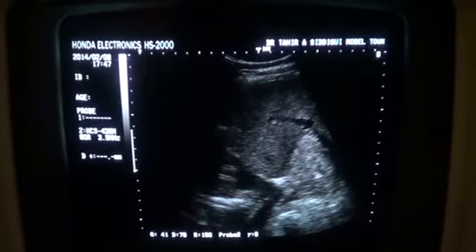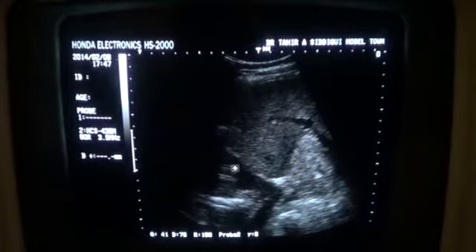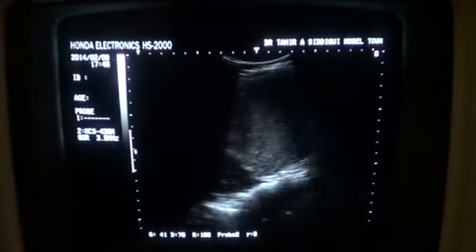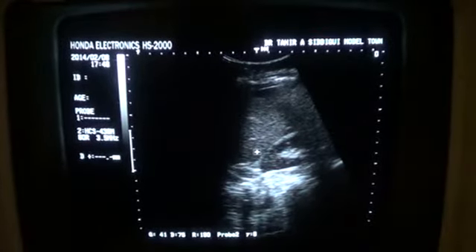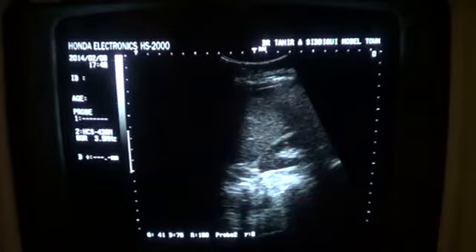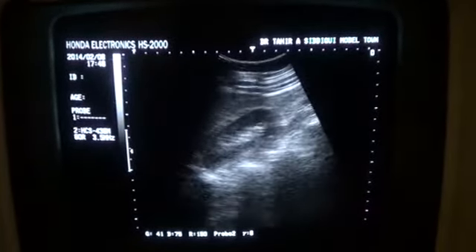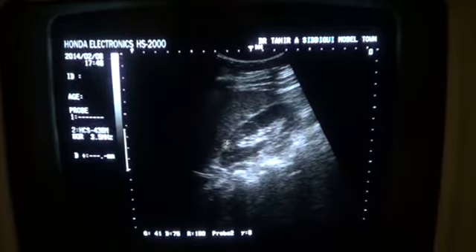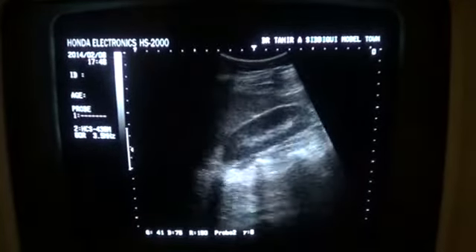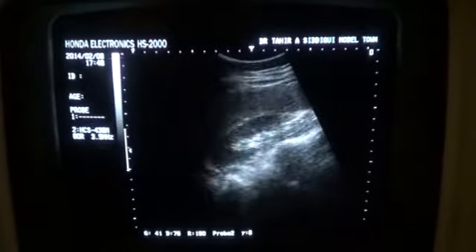As you can see, this is the fluid above the diaphragm, this is the lung tissue, so right pleural effusion is seen. This is the kidney. We see that the upper pole of the kidney is normal, no mass is seen in this region. The kidney appears normal. Compare its echogenicity with the liver, and the kidney is normal, no focal lesion seen relating to the kidney, no calculus, nothing.